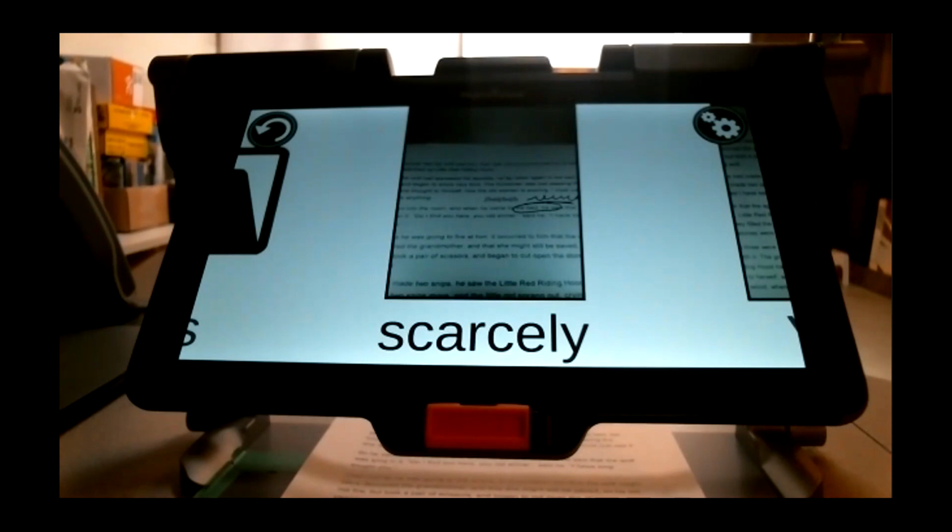So I have a little question. It would be nice to have kind of a cheat sheet for all those gestures published along with the recording and distributed amongst the participants. And I'm totally on board with that. I have started an Excel sheet with all what I've just said, and I'll be sharing that Excel sheet with you guys along with the recording. I think the recording will appear more rapidly in the YouTube channel than my cheat sheet, but I'm working on the cheat sheet. I started that today because I find it very, very useful.